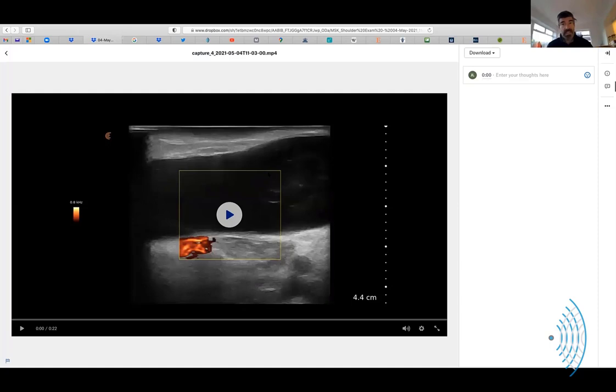And if you see something like that, then you've got some sort of pseudoaneurysm or some sort of aneurysm. And that's a bigger deal and needs immediate attention. One day you'll see that in a groin, someone will come back having had an angiogram or something, or just bashed themselves somewhere, and it'll be a one in 10,000, one in 20,000 scan. But once you start seeing arterial flow, once you start seeing fast flow, then that has to be understood at a medical level.